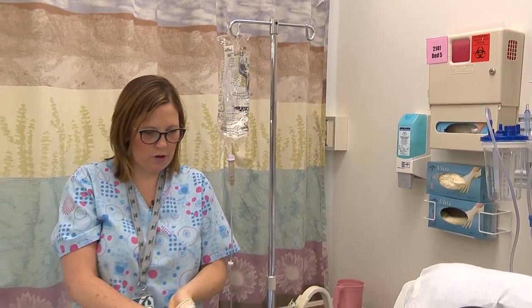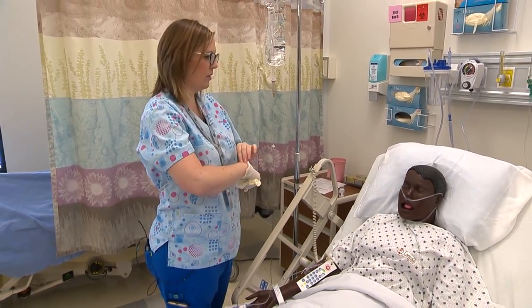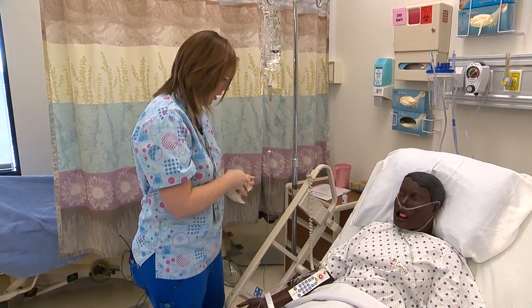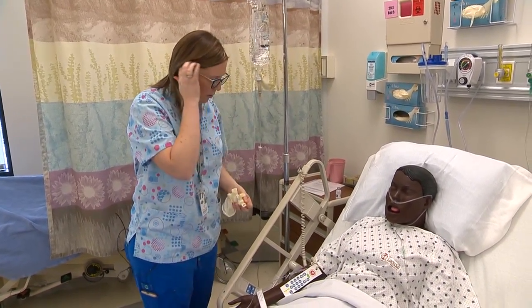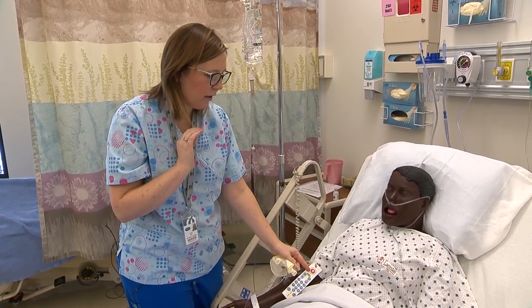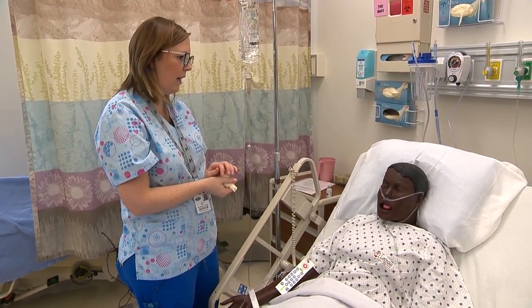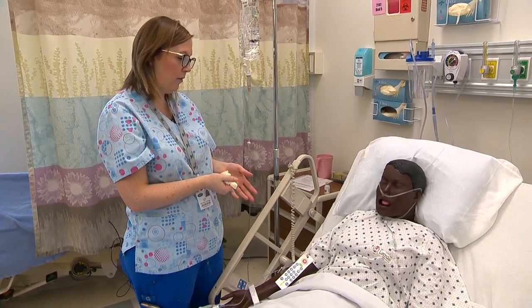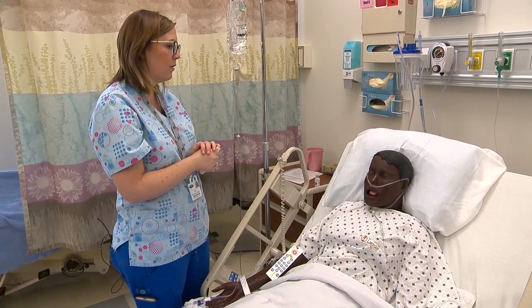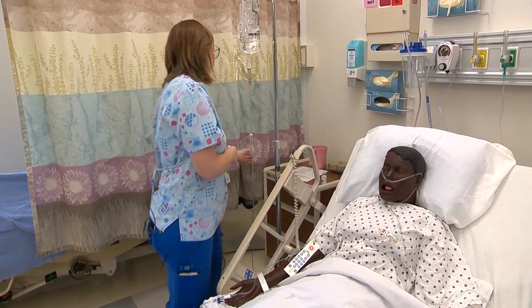Morgan, I've administered your medication — I hope this is going to give you some relief. Use your call light to call me if you have any issues or need anything. Otherwise, I'll be back in about a half hour to check on you and make sure the medication is working properly.